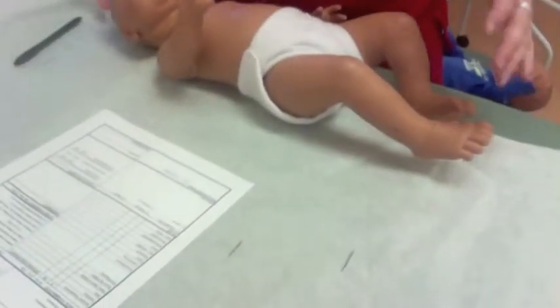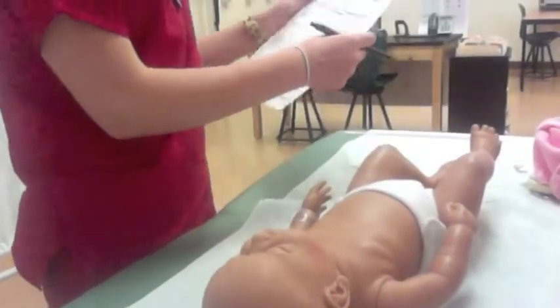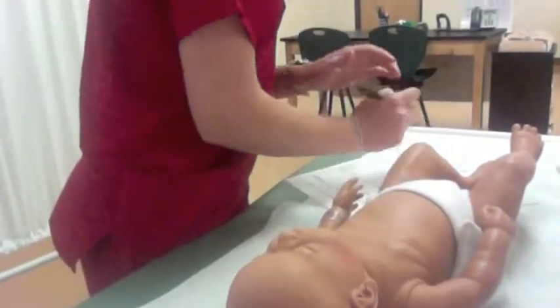Now we're going to take the baby's weight. So we're going to put the baby on the scale here and make sure that the head is secure. And then you're going to just move the weight until this is balanced. And that's the weight of the baby. So we're going to go back to the exam room. And we're going to mark here under weight.